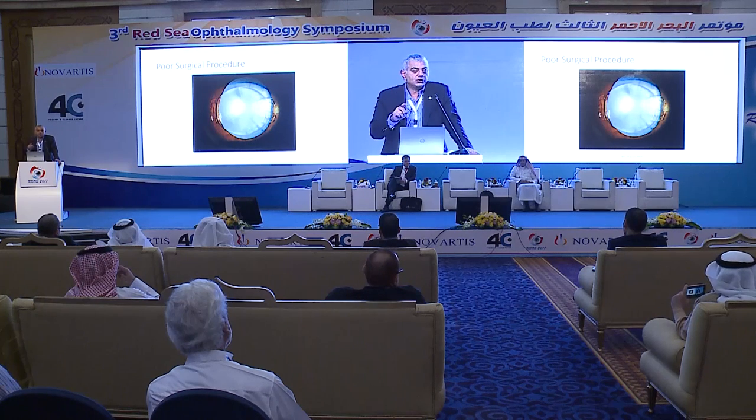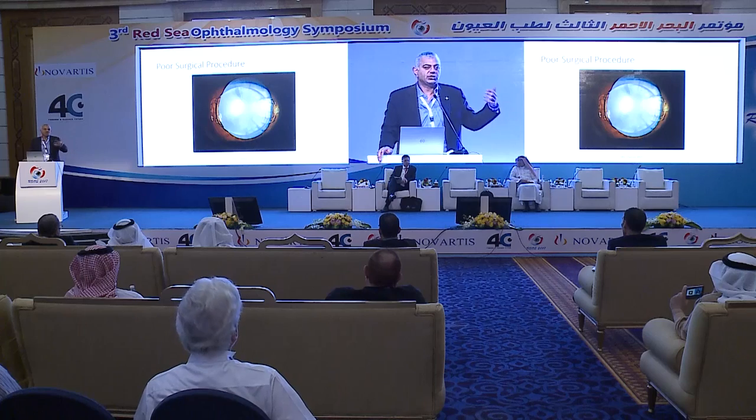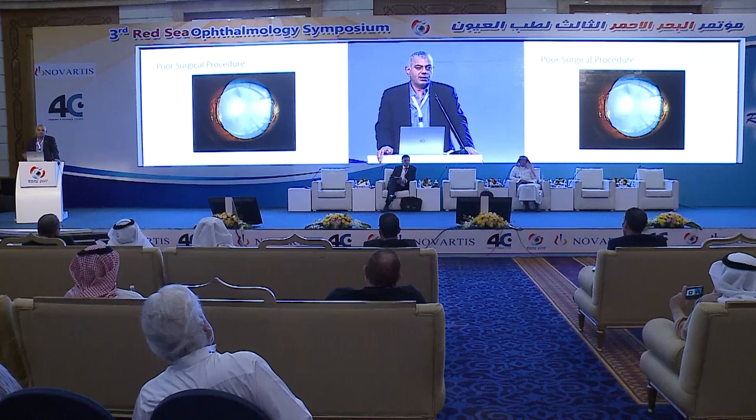Remember that a poor surgical technique is the most common cause for cataract with phakic intraocular lenses, and this is an example. I've seen this patient who had an Artiflex lens done somewhere else, which is not known to induce cataract. The patient came with a white cataract and fixed dilated pupil only because of a poor surgical technique.